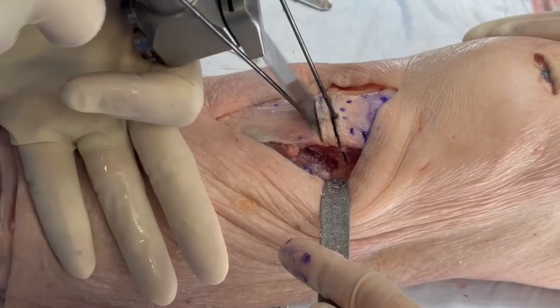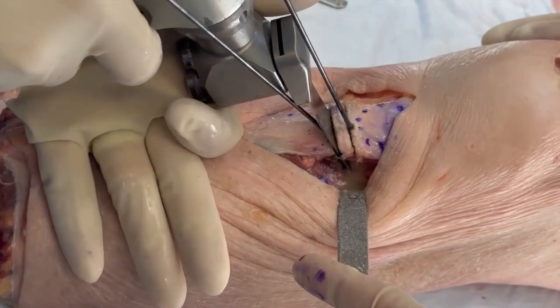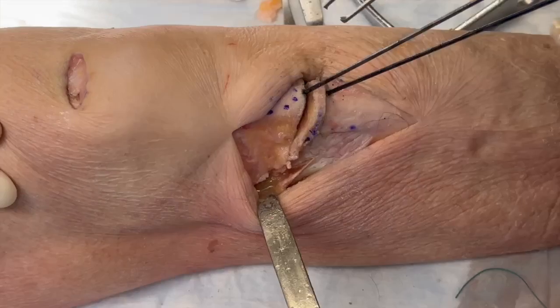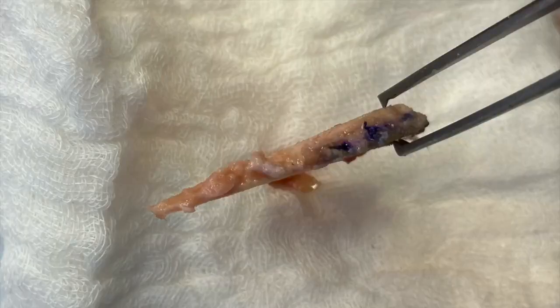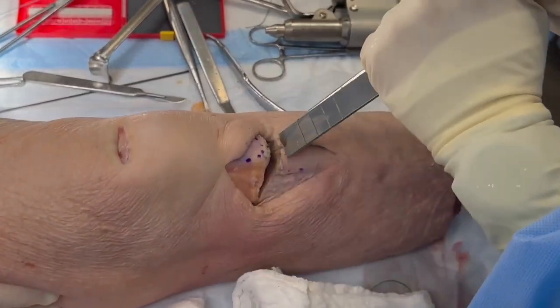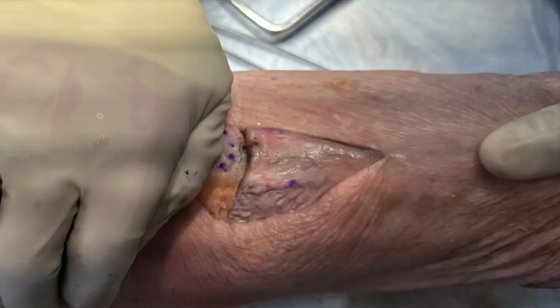The second cut is slightly angled. You aim roughly for the level of the waist of the fibular head. You remove the wedge. You can use that for bone graft if you want to do a two-stage revision. I finished the osteotomy with an osteotome. If this doesn't go easy, you want to revisit your osteotomy gap with small pituitary rongeurs. You do a hyperextension moment to close the gap.